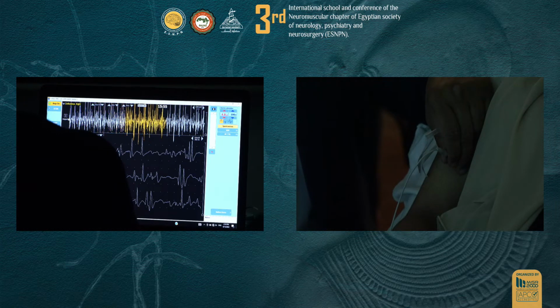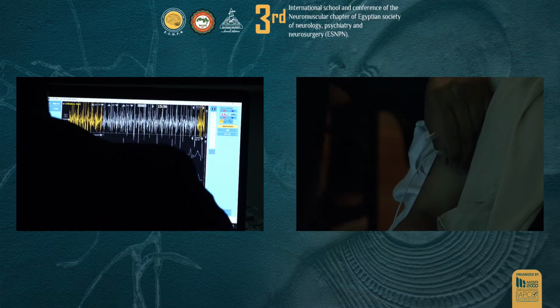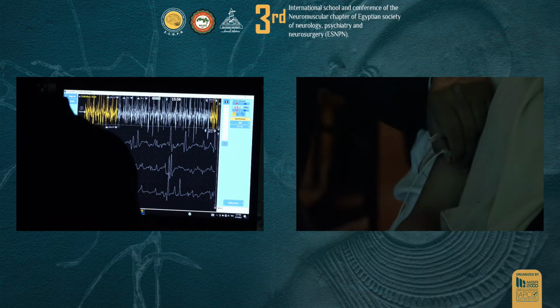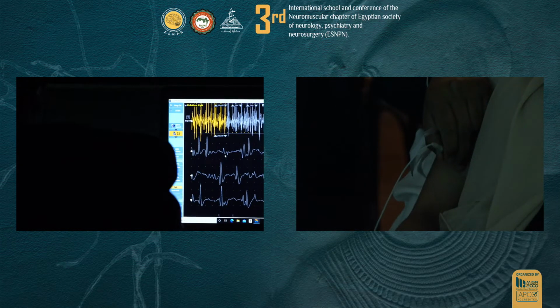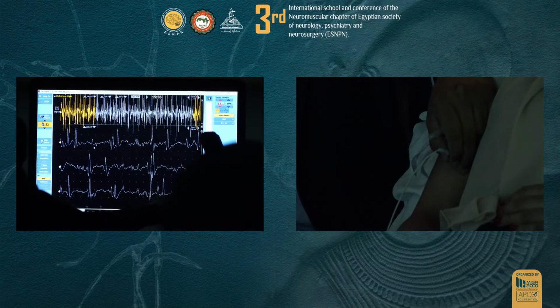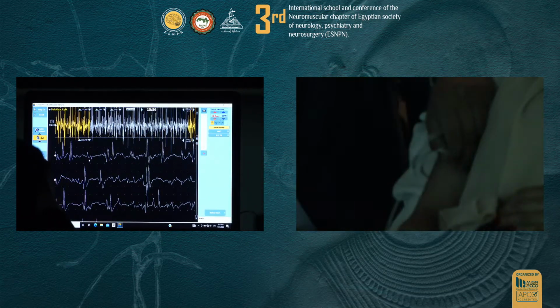Can I freeze it? Just to show you these motor units over here. Can I have a pointer, or is there a pointer here? You see this? Am I covering it? Can you move it a little back? Angle it a bit, pull it towards you. I just recorded some motor units from her. Is the pointer working? What button? Is this the button? Yeah.